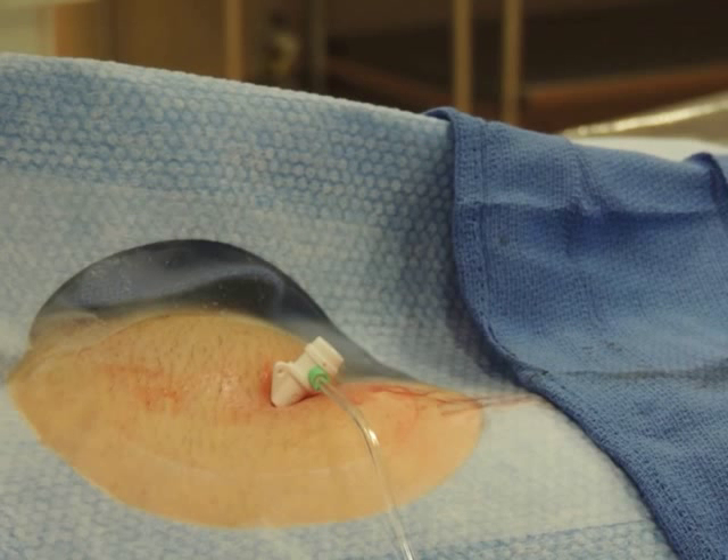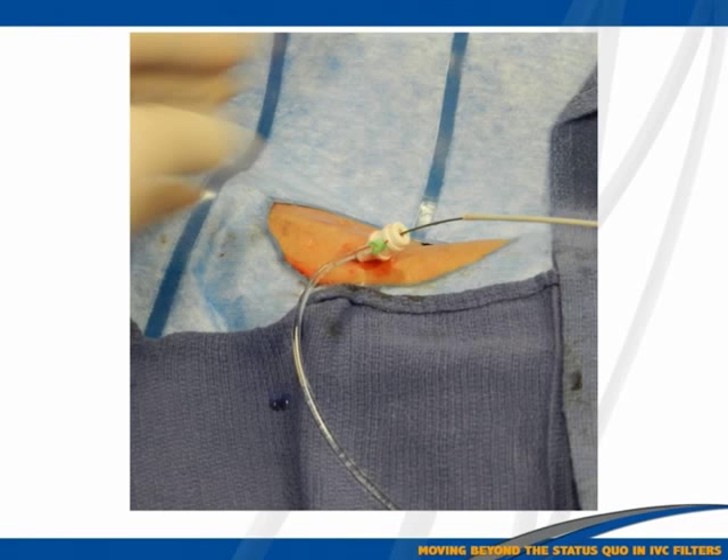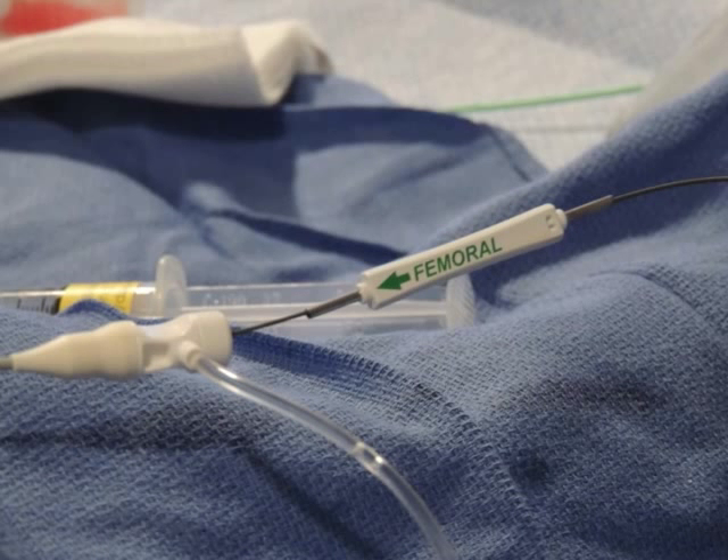Access the groin as usual, then through a 6 French sheath — which is independent of the device itself, any 6 French sheath will do — perform a venogram, then insert the J wire. The next step is to introduce the delivery system over the wire, then introduce the cartridge over the wire. You can do this two ways: from the back end of the wire, which is the stiffer, straighter end, or through the angled end. In either case, keep your finger on the other end so you don't inadvertently push the wire out.